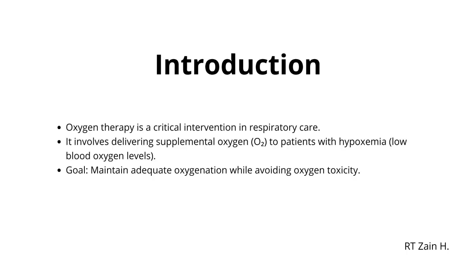Introduction. Oxygen therapy is a critical intervention in respiratory care. It involves delivering supplemental oxygen, O2, to patients with hypoxemia, low blood oxygen levels. Goal: maintain adequate oxygenation while avoiding oxygen toxicity.